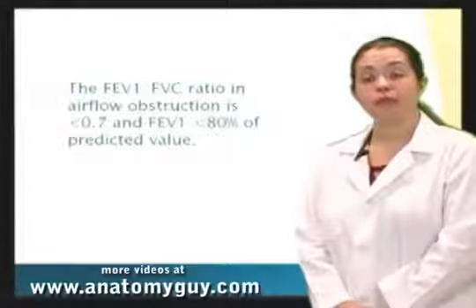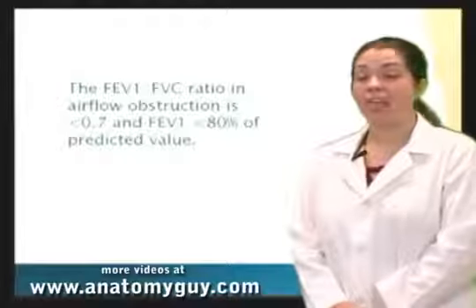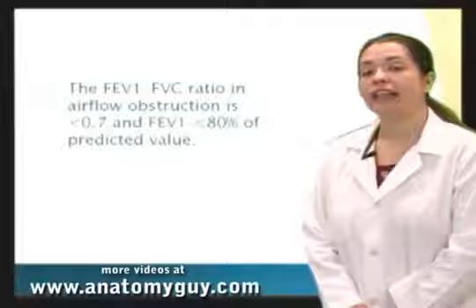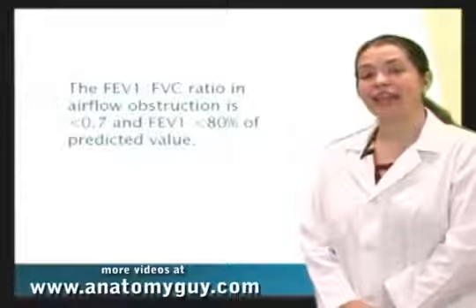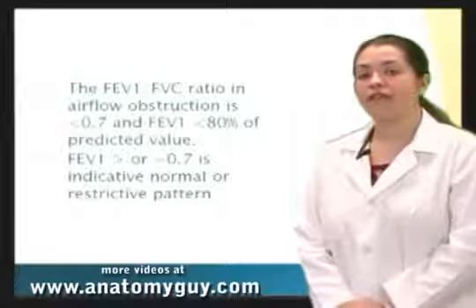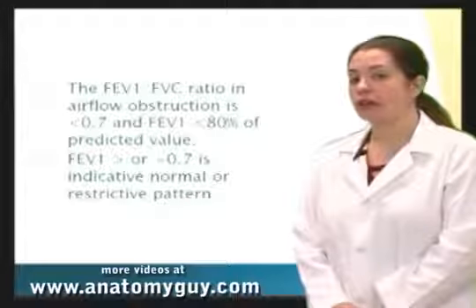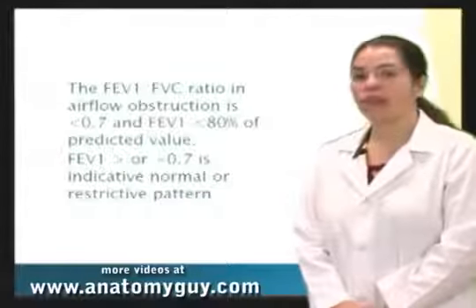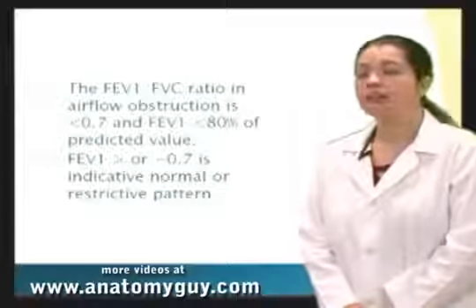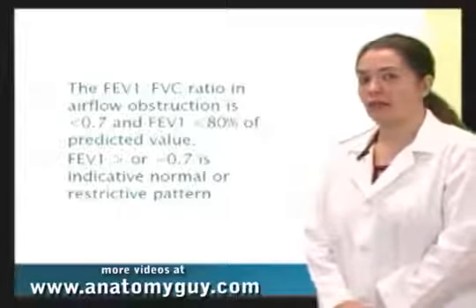In airflow obstruction, the FEV1-FVC ratio is going to be less than 0.7, and the FEV1 is going to be less than 80% of predicted value. If the ratio is greater than or equal to 0.7, that is indicative of a normal or restrictive pattern. Let's go to a graph to discuss this a little bit more.